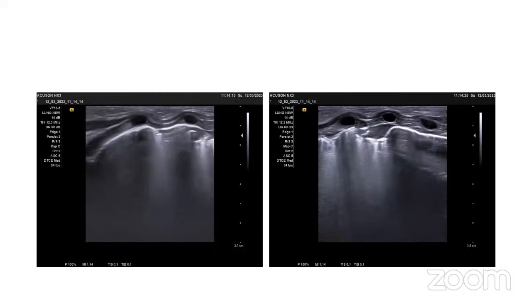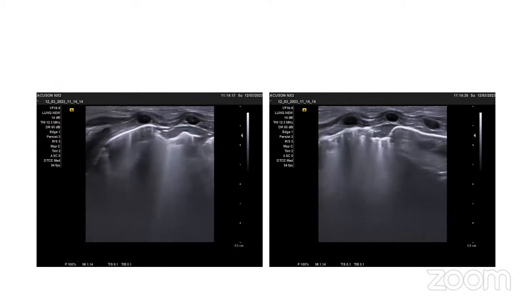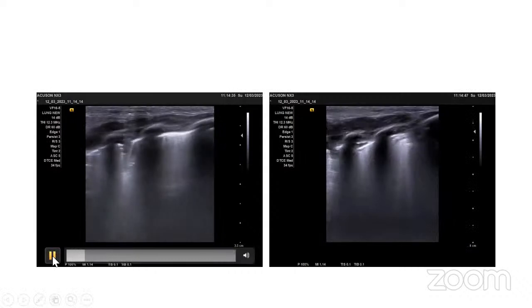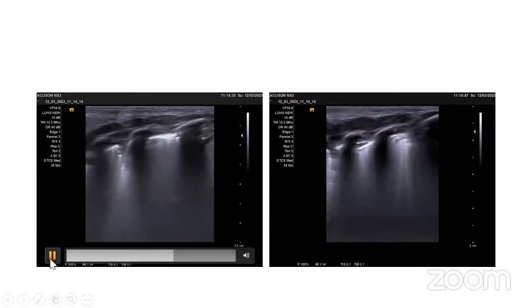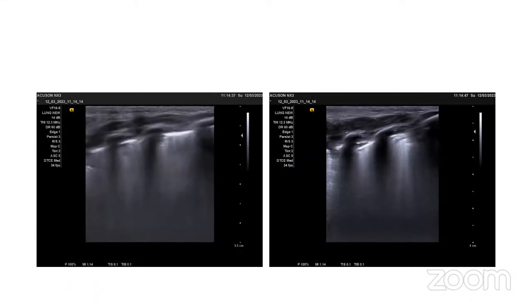This is a good pleural sliding, thin pleura, but there are a lot of B lines with B profile on the right upper anterior zone, and here there is a shred sign for me. I don't know if I'm doing this very well, but there is some shred sign on this view on right R1, a consolidation. I don't know if this is right or not.